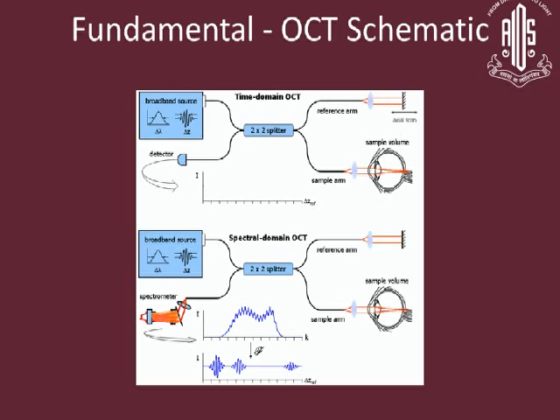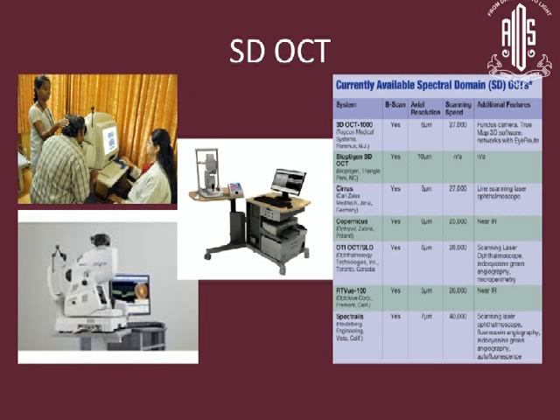detector region. In spectral domain OCT, it is again split by a dispersive device into lights of various wavelengths, and then it is analyzed by a spectrometer. It is Fourier transformed, and the final image is obtained. This is also called Fourier domain OCT, and it is named after Baptiste Fourier, the French mathematician who derived this analysis for calculation.